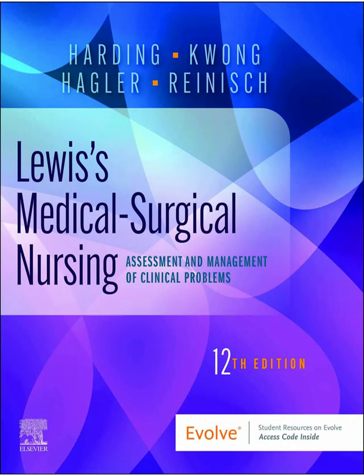Okay. We've gone from the SA node through the atria, down the AV node with the blocks. Now, the really scary ones, right? When the ventricles themselves start acting up or taking over, this is where things can get truly life-threatening fast. Yeah, these ventricular dysrhythmias are often the most urgent ones we deal with. Let's start with premature ventricular contractions, PVCs. These are early beats that originate from somewhere down in the ventricles. On the ECG, they look wide, bizarre, distorted compared to the normal QRS.